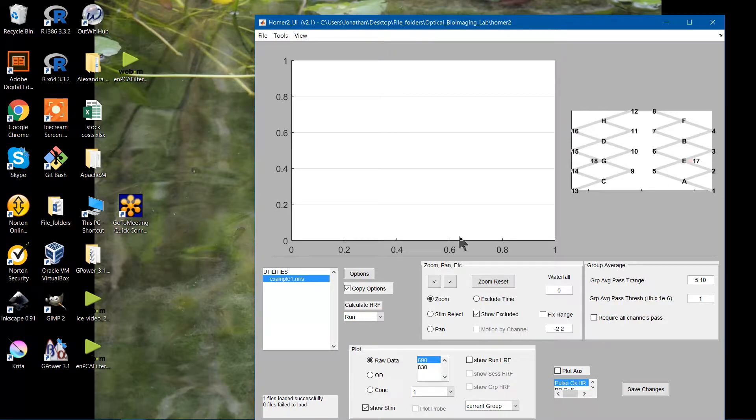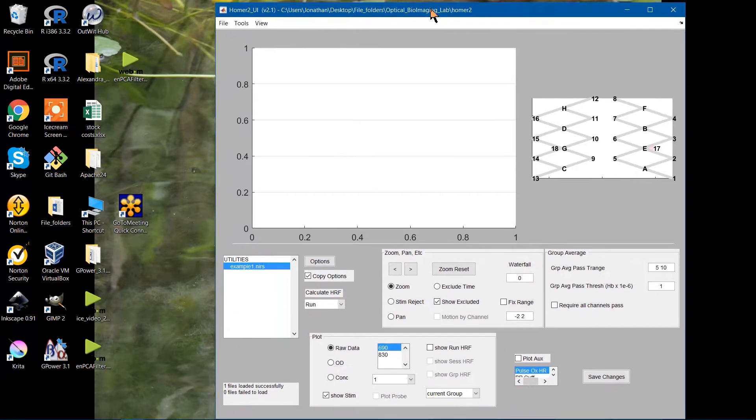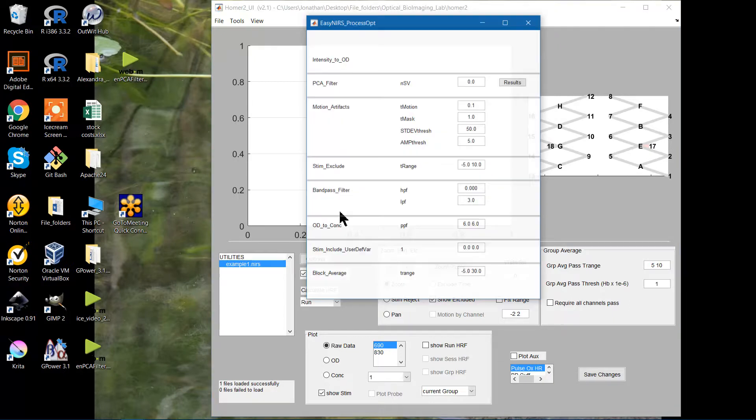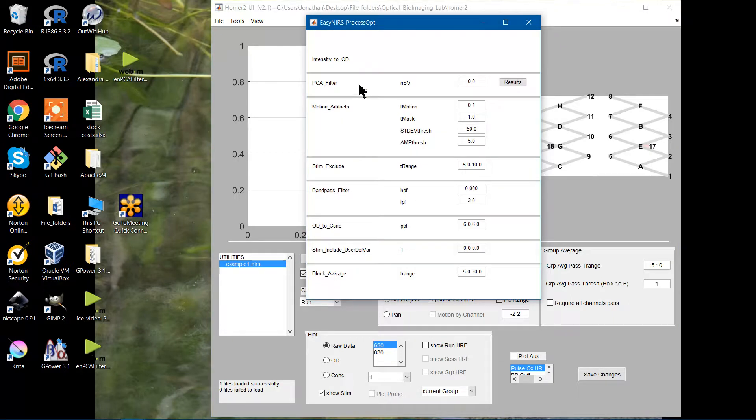So if you open Homer without uploading your own custom processing stream, if I go to options here, you'll see the default. Previously I'd done a video on the intensity to OD function. I'm now on the PCA filter.